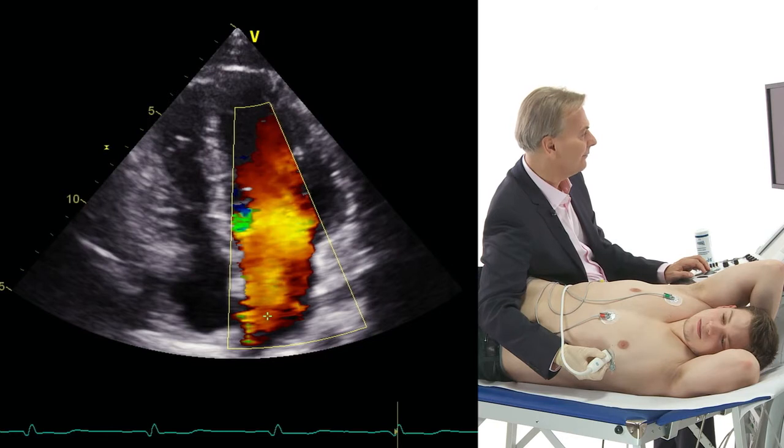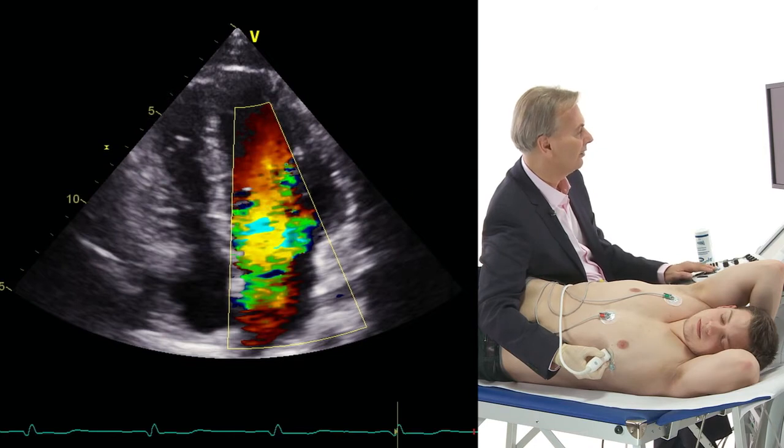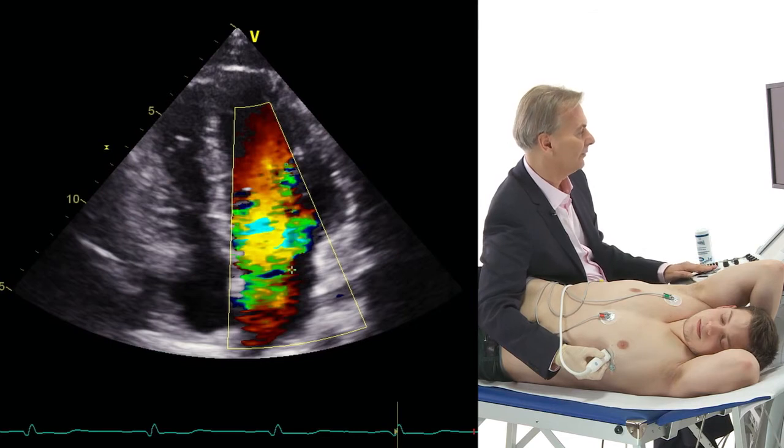Now, how do we interpret this? Here is a frame during the filling phase during diastole. We see red, in other words, flow from the left atrium into the left ventricle. This is normal flow. If we just go back a bit, we see that there's even a frame where the velocity is so high that you have this mosaic color. The reason is simple. He's a young individual and he has a very high cardiac output.